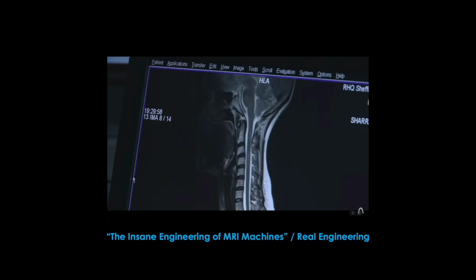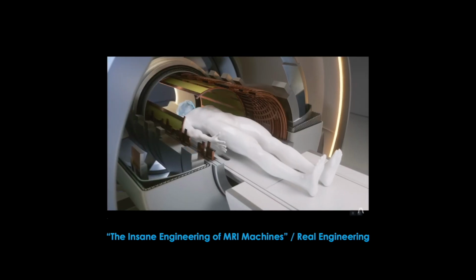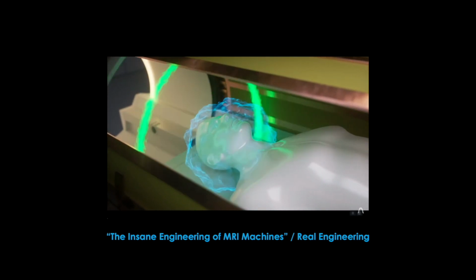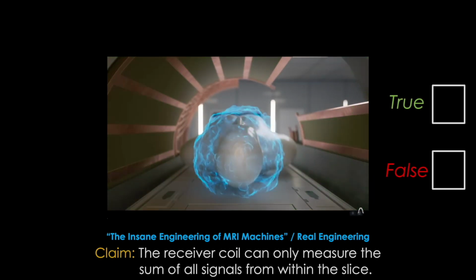Next clip. The signal is collected as a sum from a singular slice. The machine needs to form a 2D image of each slice. There is one extra layer of complexity, since the receiver coil can only measure the sum of the signals from all the decaying hydrogens in the slice. Claim. The receiver coil can only measure the sum of all signals from within the slice.